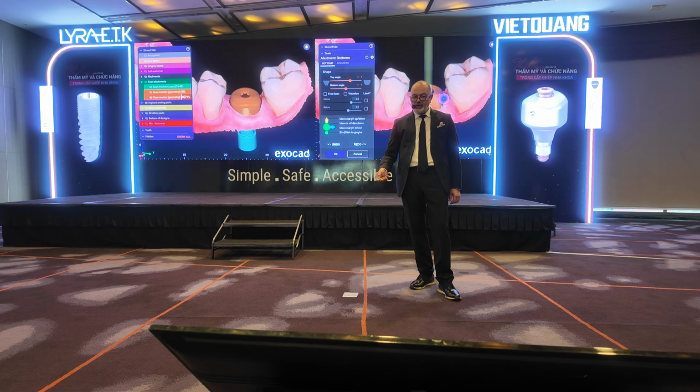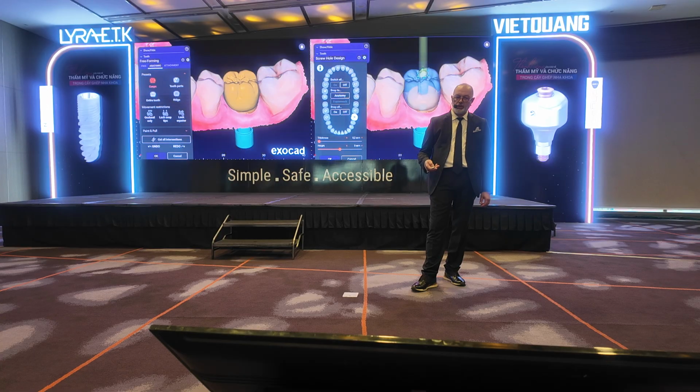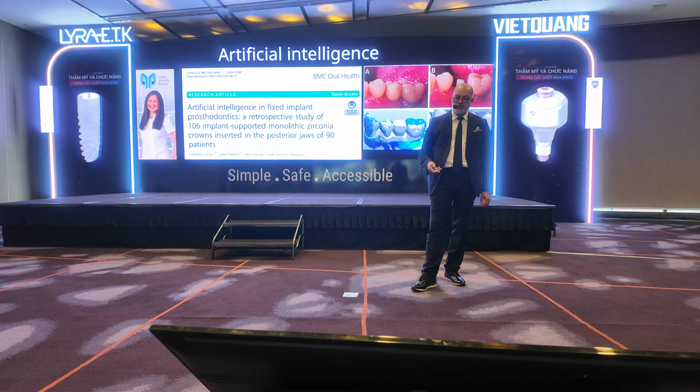He will define the limit between the internal part of the iPhysio and the external part, which will be glazed, not polished. So this is the final restoration.